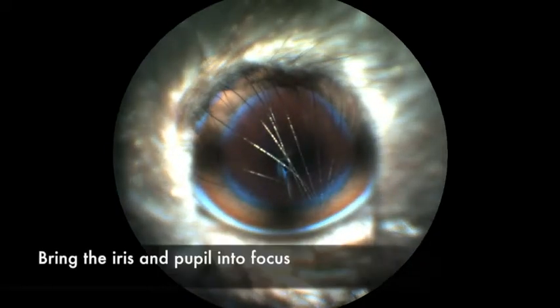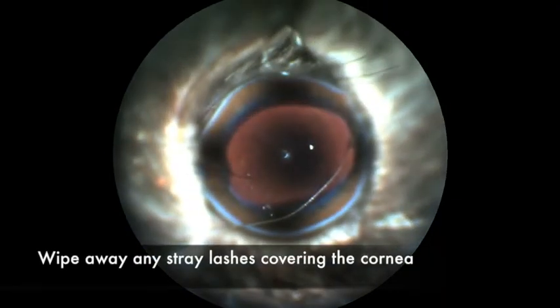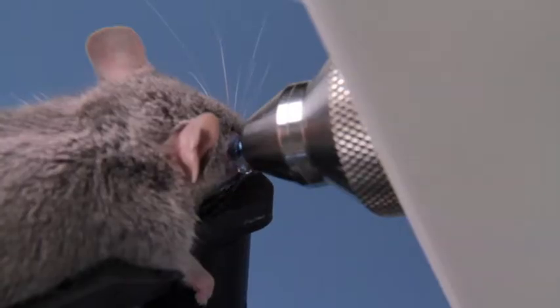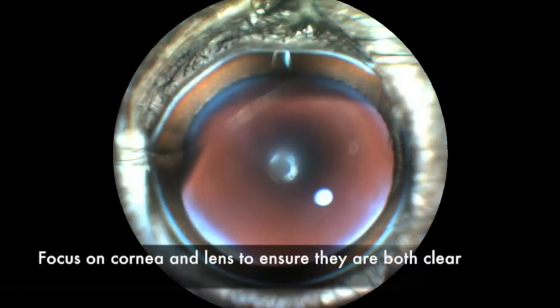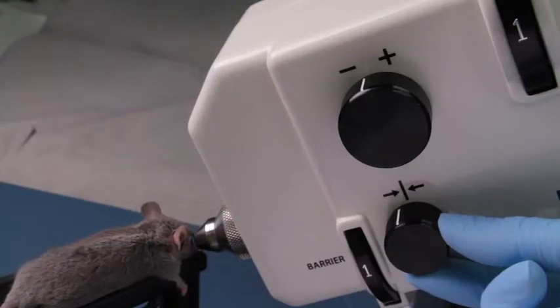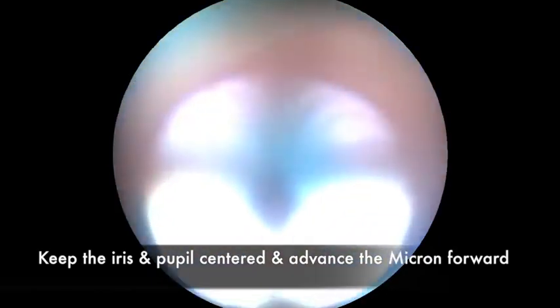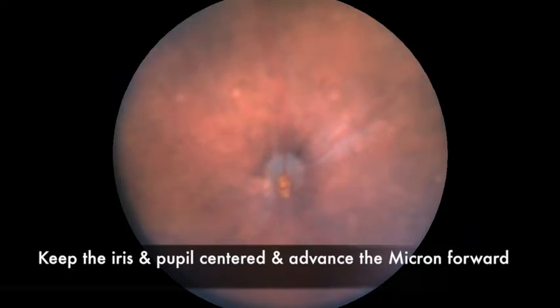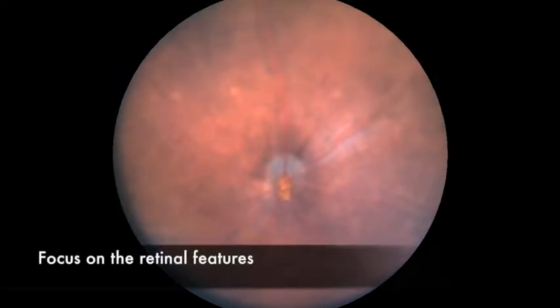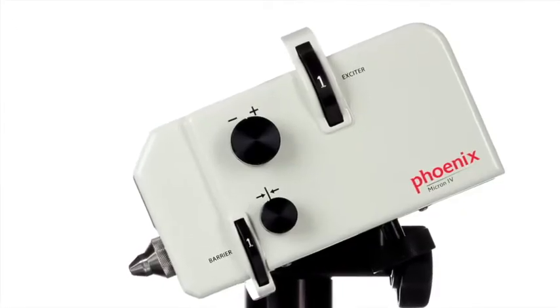Adjust your focus on the iris of the eye. Wipe away any stray eyelashes covering the cornea. As you advance the camera closer, continue to focus and check that the cornea and the lens are both clear. You'll see the red reflex of the retina in the pupillary space. With the eye centered in view, slowly move the camera forward to couple with the gel and the cornea. Adjust focus and illumination to optimize details of the retinal features. Capture still images or video from your Micron system.